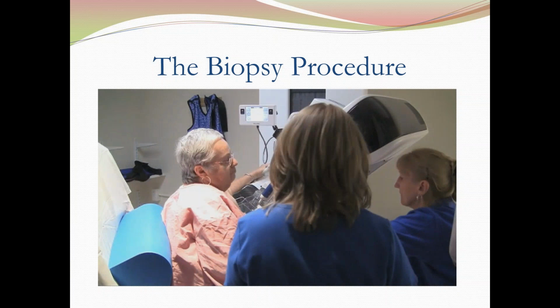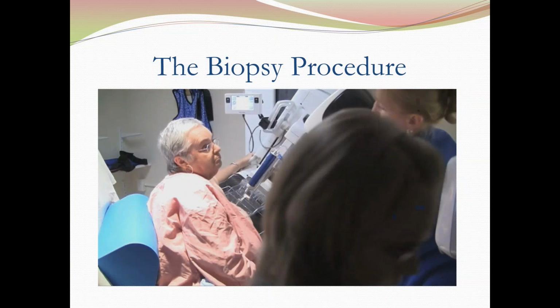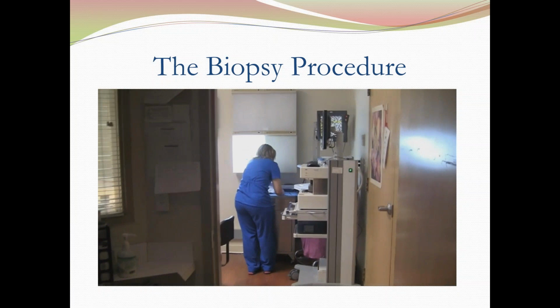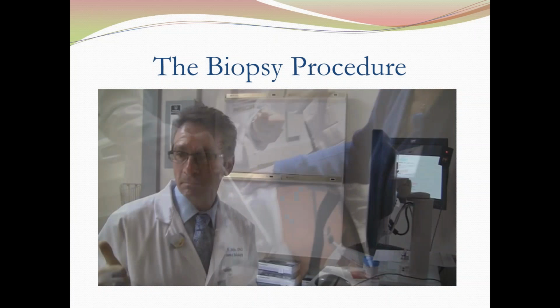We always radiograph our specimen, and we radiograph it for calcification. But even when we're doing masses, we'll radiograph it, and that can be helpful sometimes because you can literally see the mass within the fatty tissue. And we got our calcifications, so I'm happy with that.